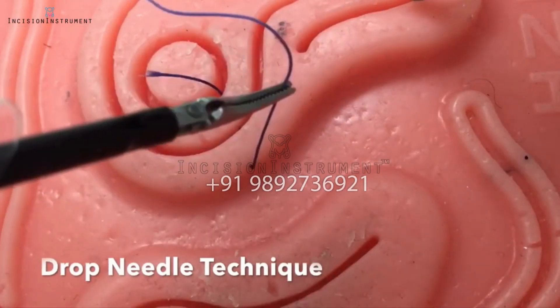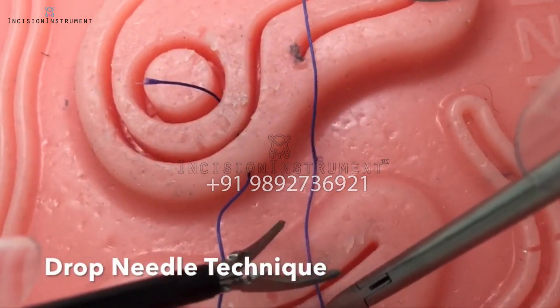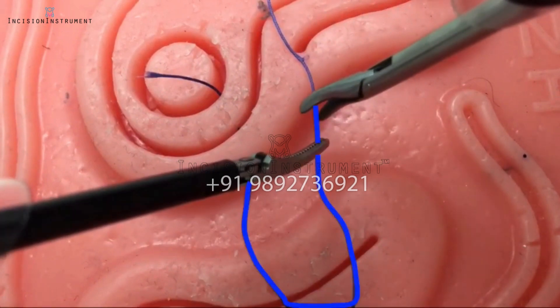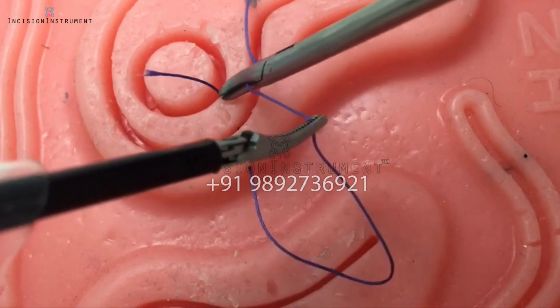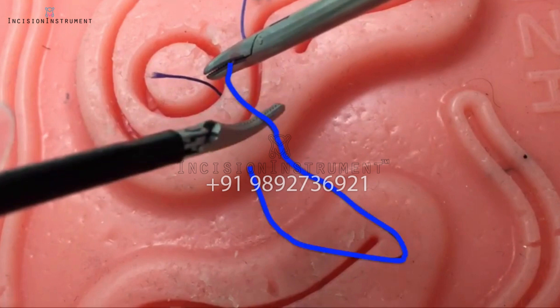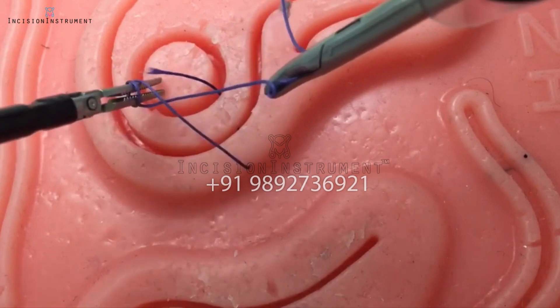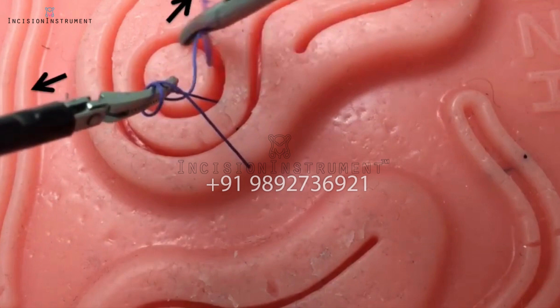Knot tying. This video will demonstrate two intracorporeal suturing techniques. The first one is the drop needle technique. The setup is key. First, create a long elongated U with the suture. By creating this elongated U, we are decreasing our instrument to suture angle — a key feature to intracorporeal suturing. Once the acute angle is created, place your left instrument inside the U and simply twist the suture twice around your instrument to create a surgeon's knot. Then grasp the loose end with your left instrument while pulling upward while your right instrument pulls downward.